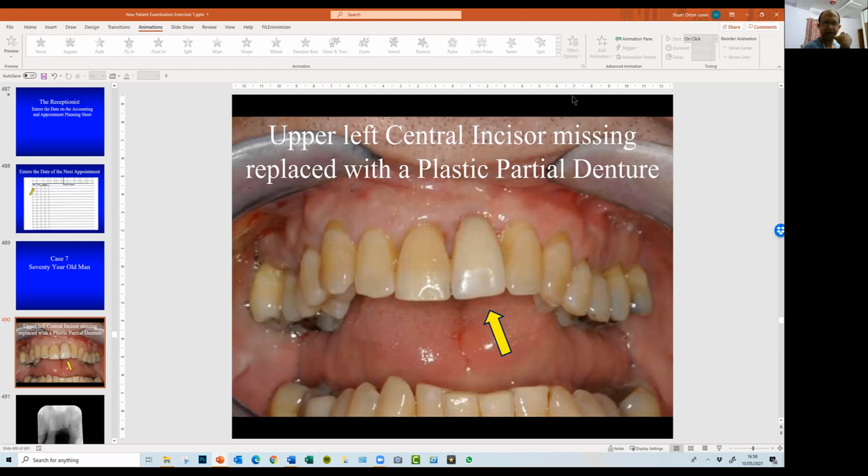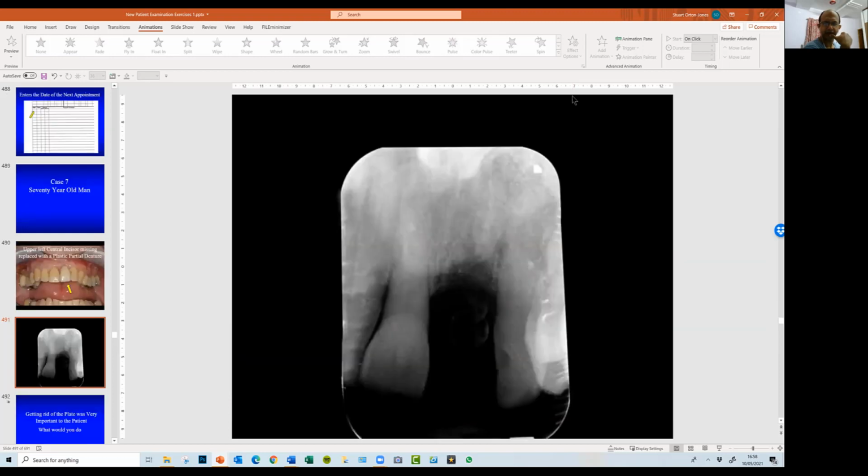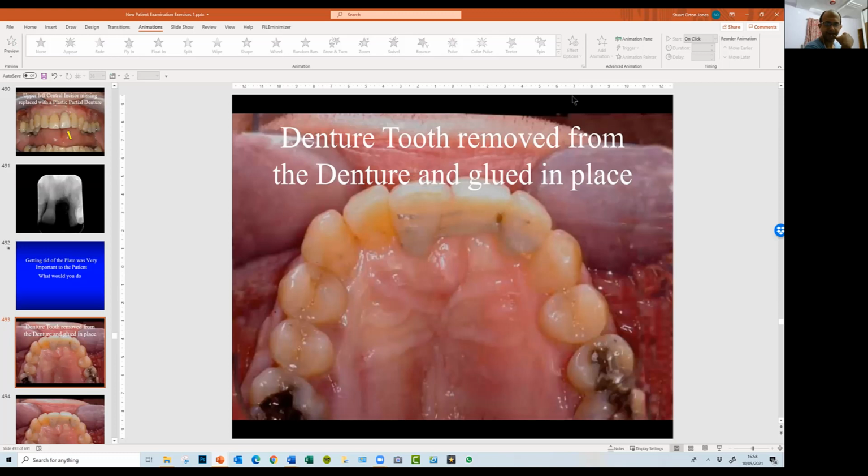Okay. So he came. We stuck the wires. I just need to make a note. I would glue that tooth in and take an impression and have the technician make 2 or 3 twist flex orthodontic wires.